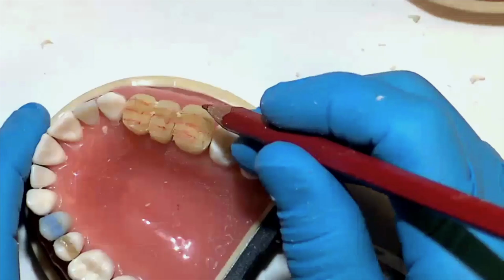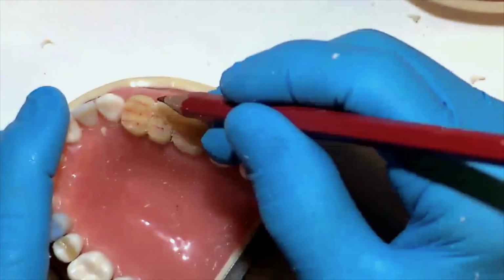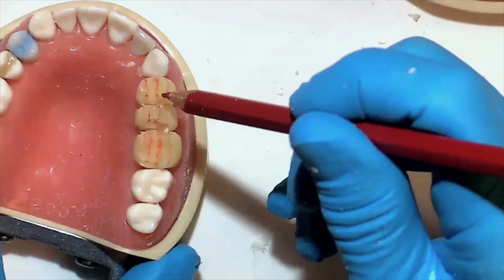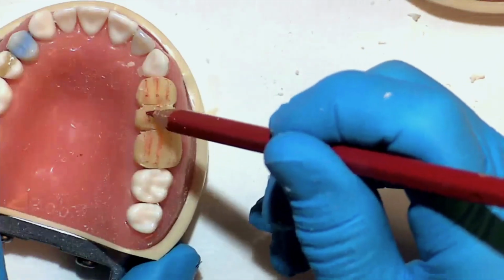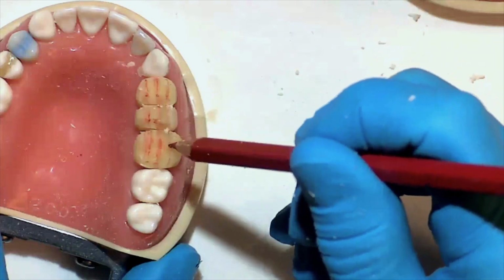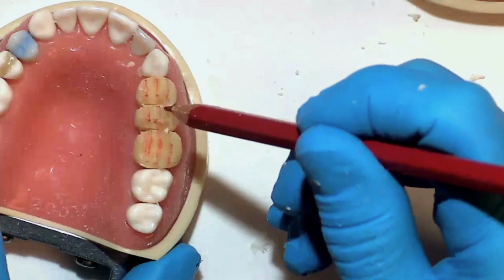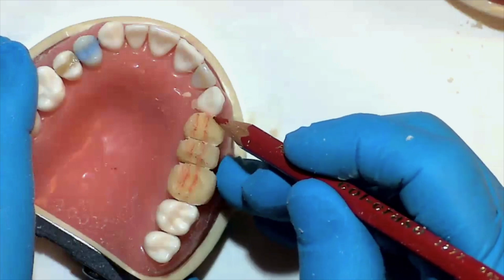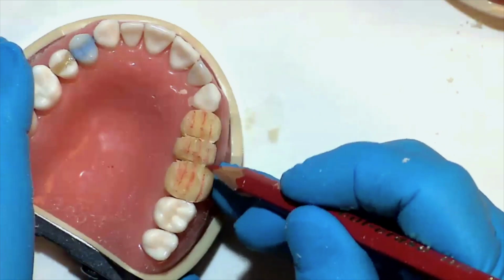At this point, we're going to replace it on the dentiform and remark our landmarks, our central fossa line here. And also our lingual occlusal line angle and the functional outer aspect of that, as well as we're going to mark here the approximation of the buccal cusp tips, which is equidistant from the central fossa as the palatal occlusal line angle, thereby composing the occlusal table.